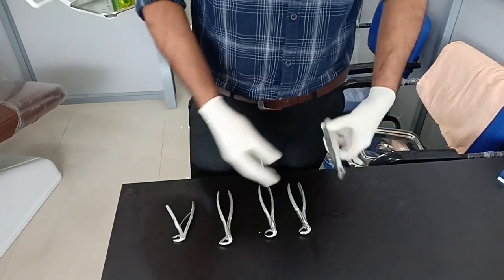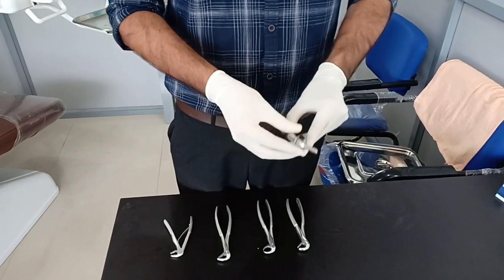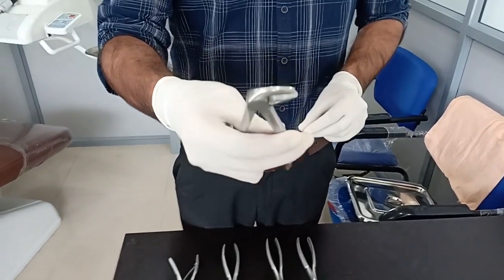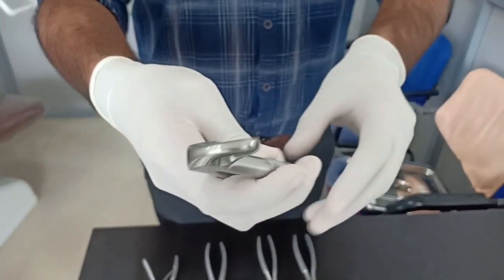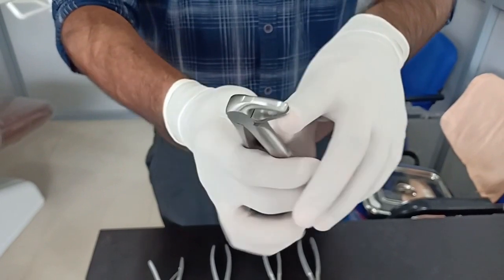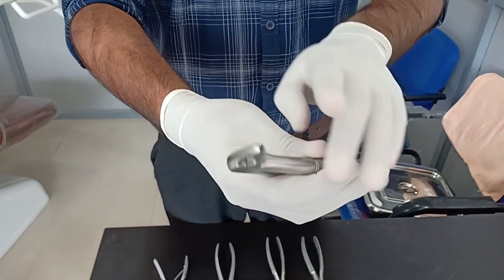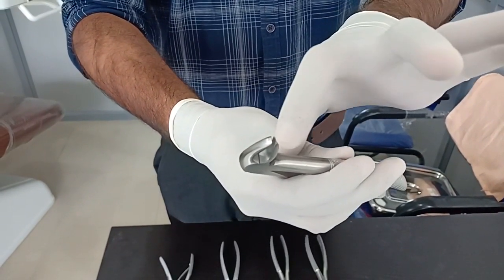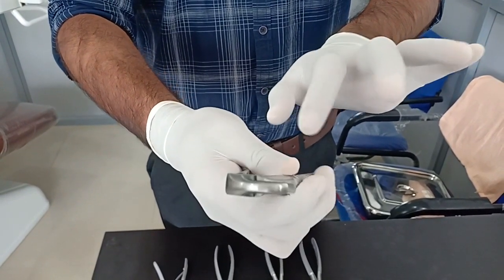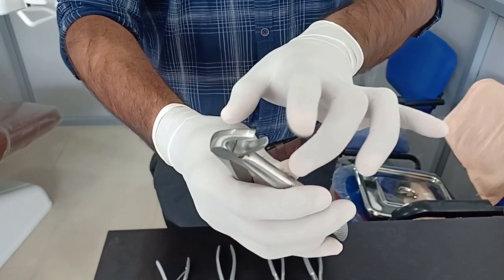We usually have anterior and premolar forceps separate. We can do extraction using this premolar forceps — this is actually the premolar forceps. We can do all the anterior and premolar extractions with this instrument. The anterior forceps beaks will be a little more closed, while the premolar forceps beaks are a little wider. So you can do extraction of anterior central incisor, lateral incisor, and premolars.